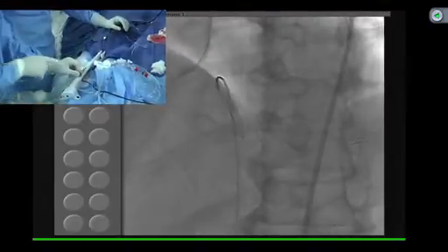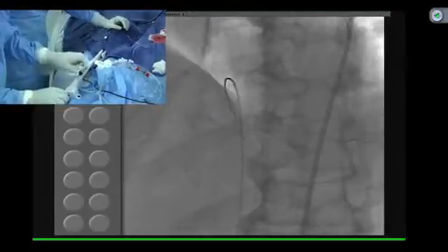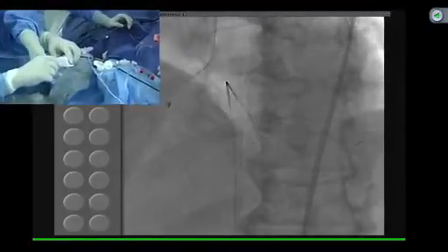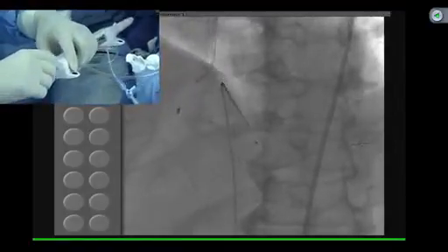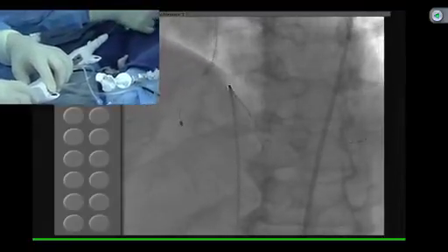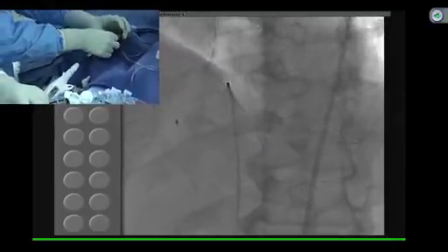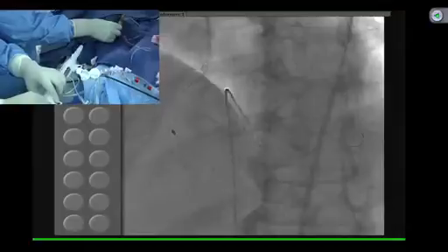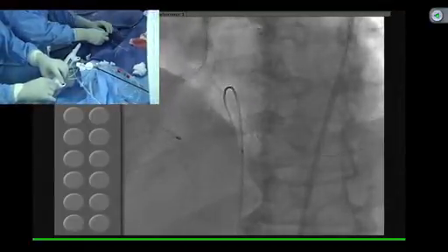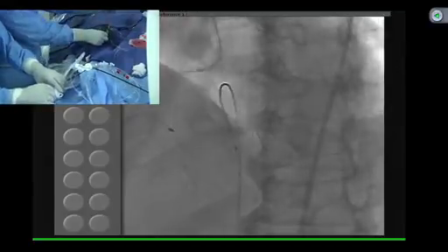So what we do is go back on the Dynaglide, and here you are going to tighten the knob. Good. Okay, let's advance. Press the brake, release. Brake release, so that this particular wire is released off the brake, and then I am advancing it slowly, manually. The guide will come back. Yeah, and that should be good enough. So now what I did is I advanced the guide, and we saw some movement in the burr. So now we are in the distal RCA.